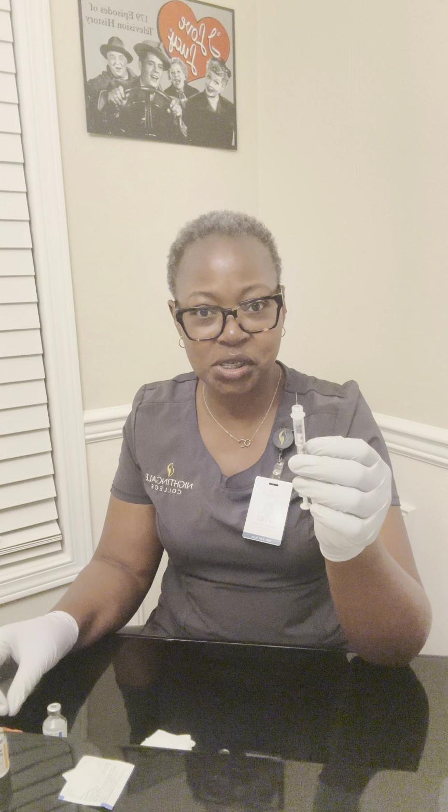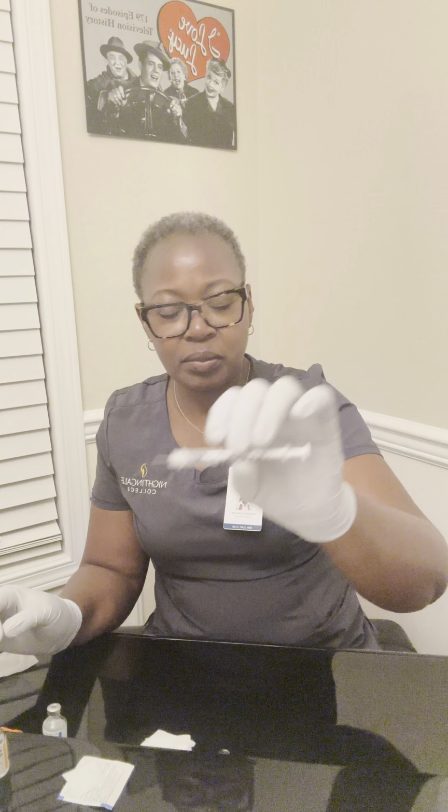I have 12 units. So I will go ahead and administer this to my patient. I have 12 units of my medication. I will put this in the sharps. I'm not going to recap. I'll just engage the safety feature. I'm not going to recap.